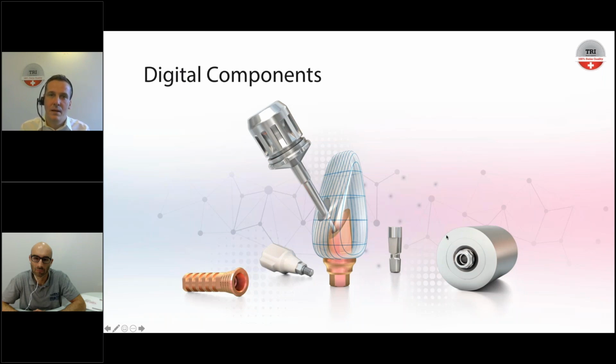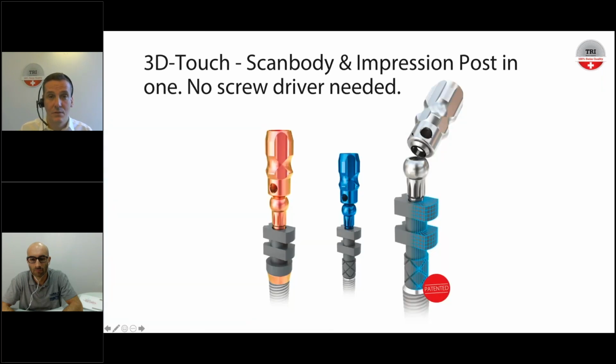It also implements our soft tissue concept, which has a narrow neck and a consistent emergence profile through all our abutment products, which is a very unique product.